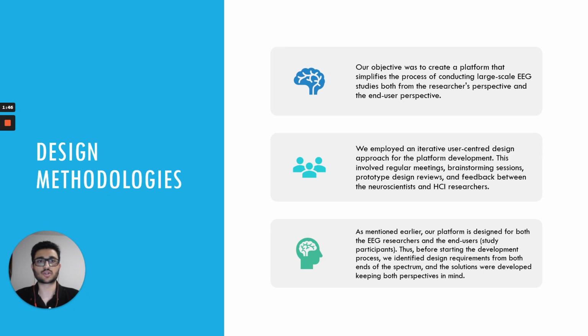Our objective was to create a platform that simplifies the process of conducting large-scale EEG studies, both from the researcher's perspective and the end-user perspective. Thus, we employed an iterative user-centered design approach for the platform development. This involved regular meetings, brainstorming sessions, prototype design reviews, and feedback between the neuroscientists and the HCI researchers involved.